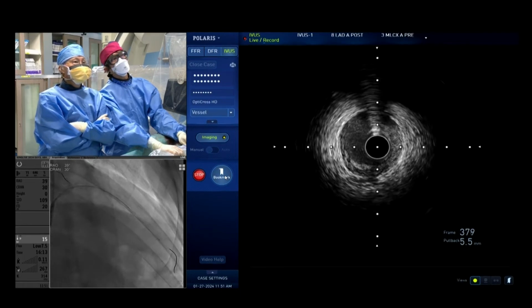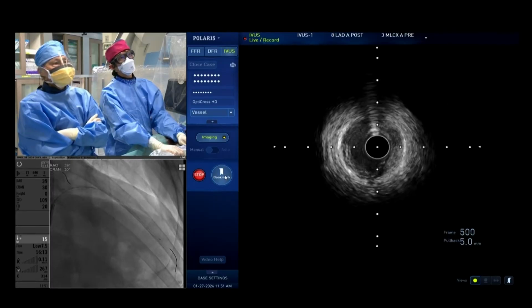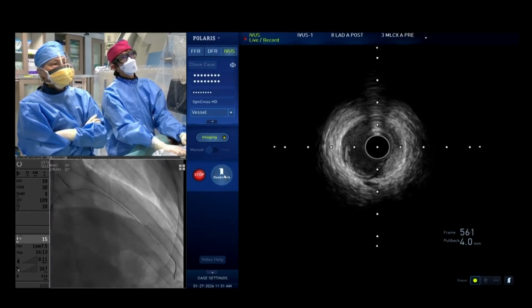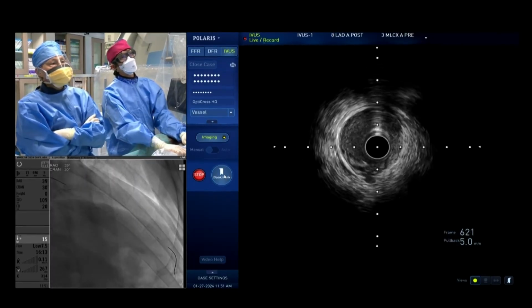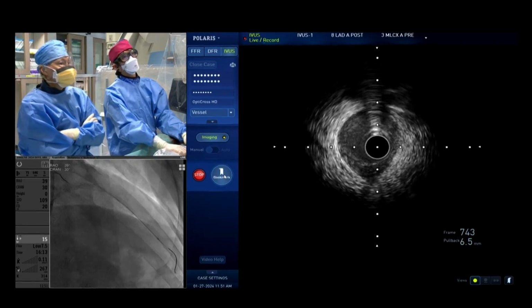But are you interrogating the distal now? We are manually looking at the distal. It looks like plaque. It looks to me it's just plaque. There don't seem to be any flaps there. Yeah. What do you think, Alan? Are you convinced?